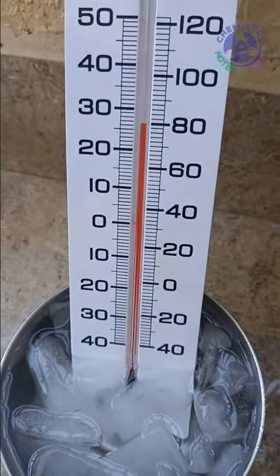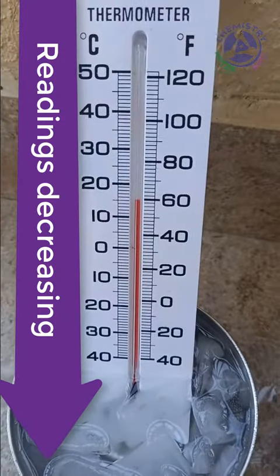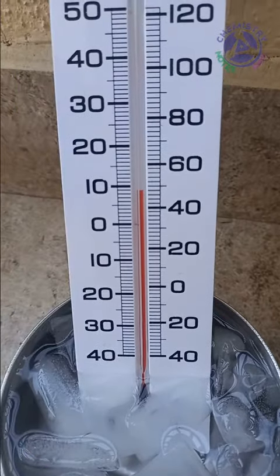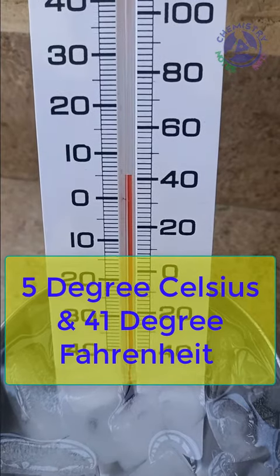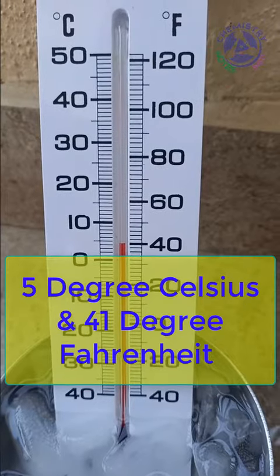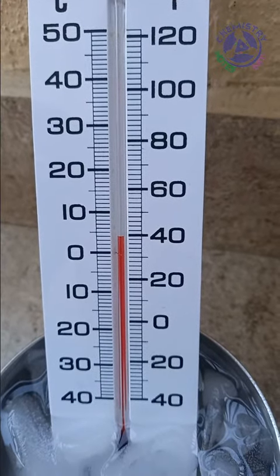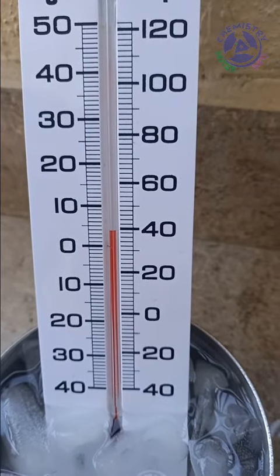When we put it in cold water, the red mercury starts going down on the graduated scale. Currently it's showing 5 degree Celsius and going down, and may become constant at 0 degree Celsius or 1 to 2 degree Celsius after some time.